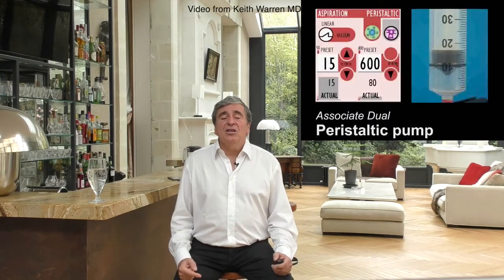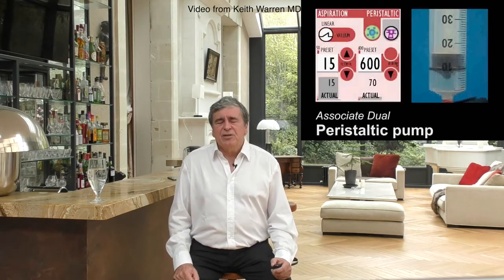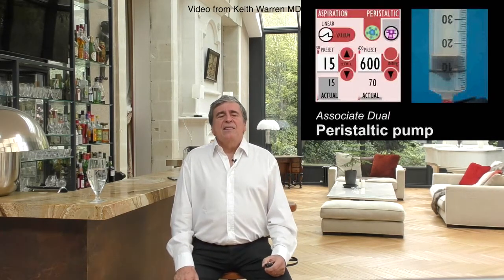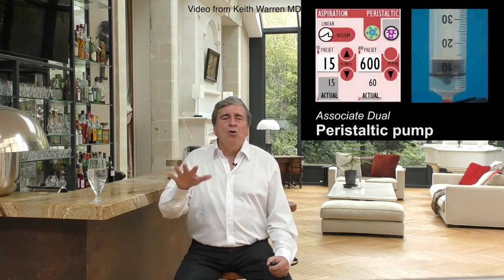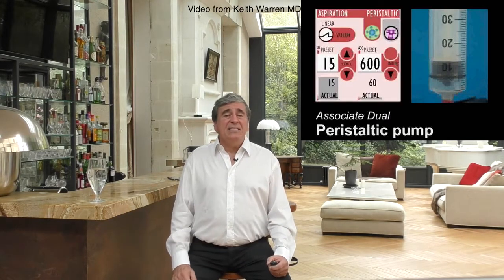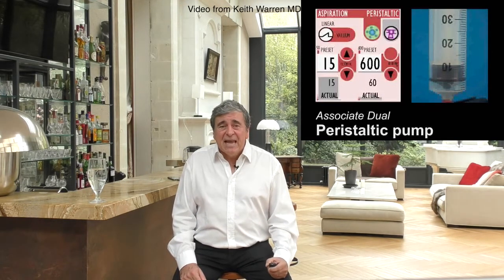What difference does it make on a practical level? First of all, for central vitrectomy at the beginning, when far from the retina, the operator working in flow control will be able to use a higher flow rate close to the maximum infusion flow rate, since he knows that even when it is in the BSS, the flow rate will be the same.